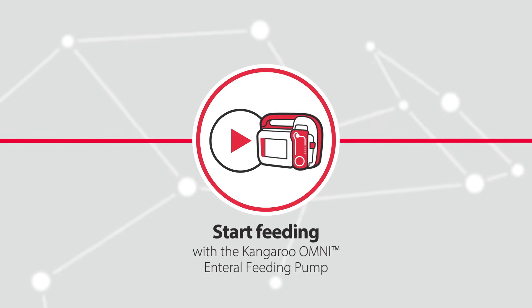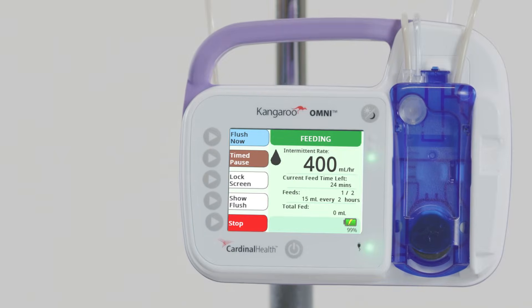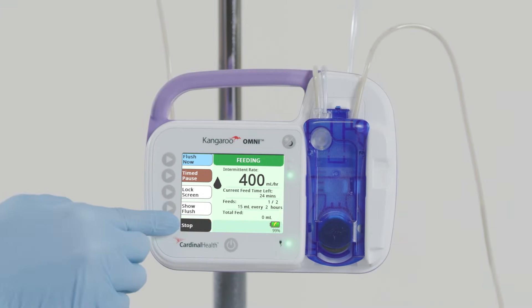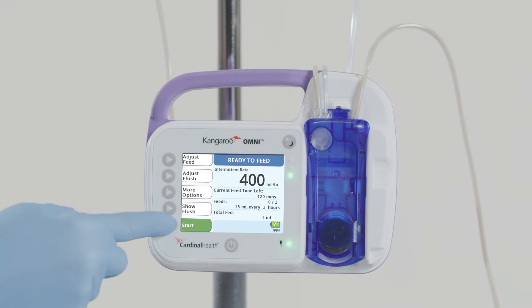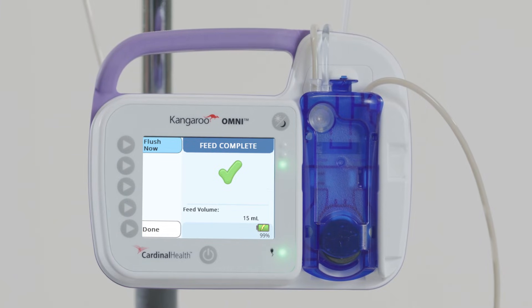Begin feeding with the Kangaroo Omni enteral feeding pump. Press Start to begin feeding. A screen with an animated black droplet means feeding is in progress. To change the rate or feed setting once feeding has started, press Stop, adjust the pump as needed, then press Start to begin feeding again. When the feeding has ended, the Feed Complete screen will appear with a green check mark. Press Done to clear the notification.